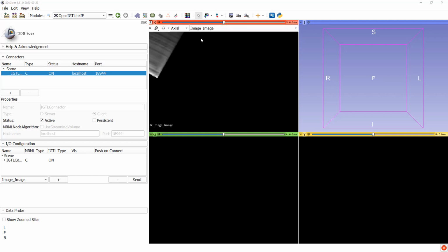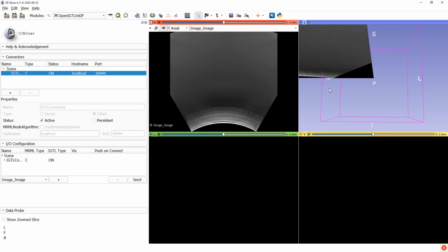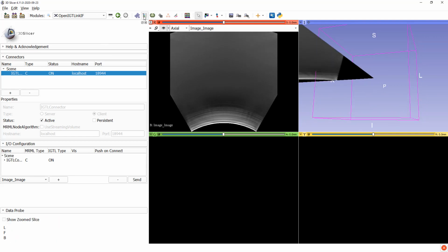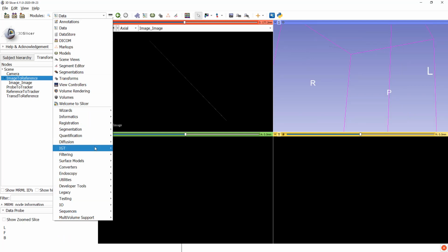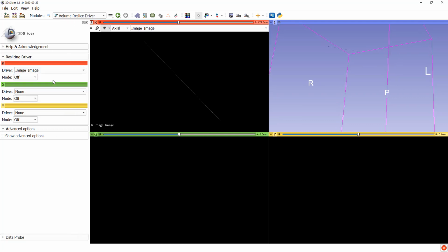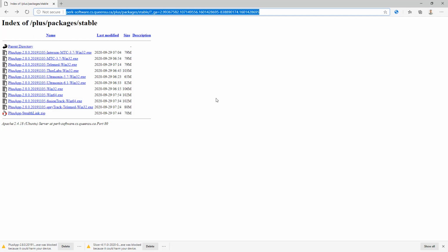So we have created an OpenIGTLink connection in Slicer, which receives the images and the tracking information from Plus. The image is displayed. If we just display the untracked image, it's going to be in its default position in the 3D viewer. We need to use the transform hierarchy to apply the image to reference transformation on the image, which we originally receive in the image coordinate system. And finally, we need to apply the volume reslice driver on the red 2D viewer so it follows the image as we move the ultrasound.